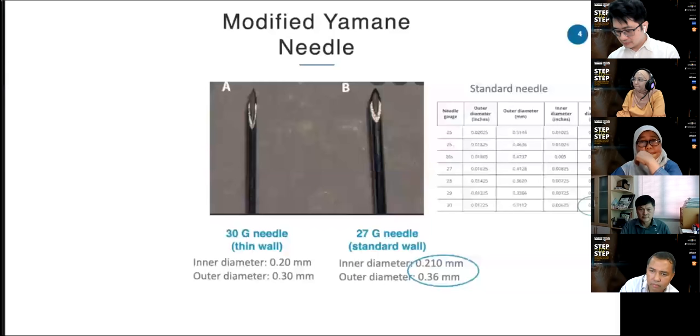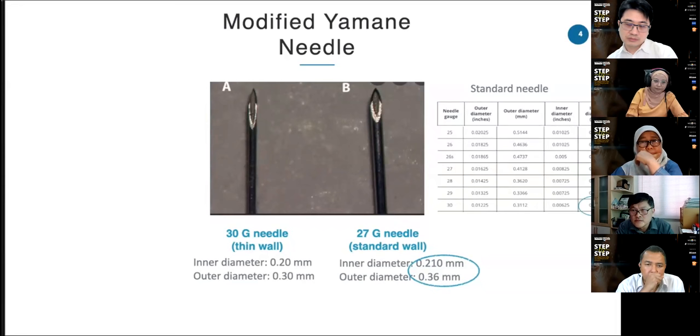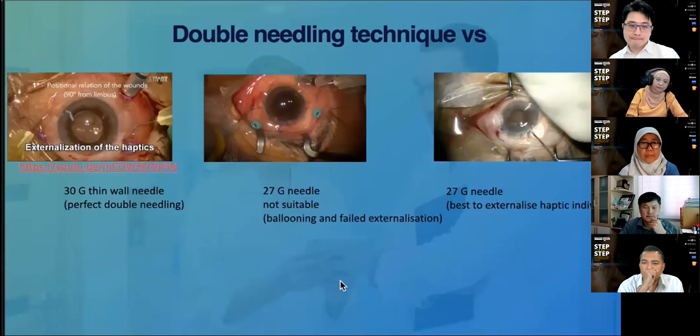Before I proceed further, allow me to highlight the needle issue pertaining to the double needling technique, which was suggested by Mr. Yamane. The 30 gauge thin wall needle has a larger lumen compared to the standard needle. In our center, we have to bring it in from Singapore, and yet we still haven't received it until now. We still make do with our standard 27 gauge needle, which is probably the closest in size compared to the 30 gauge thin wall needle. Although the figure seems more or less the same, bear in mind the 27 gauge standard needle is actually still bigger in terms of the inner diameter as well as the outer diameter. Now, let's look at one of the YouTube videos.